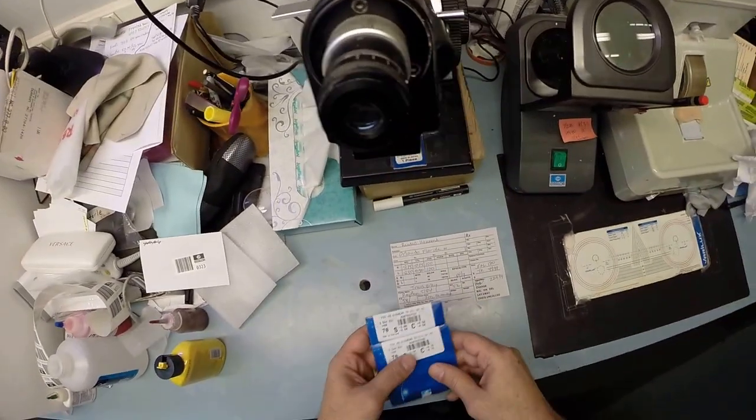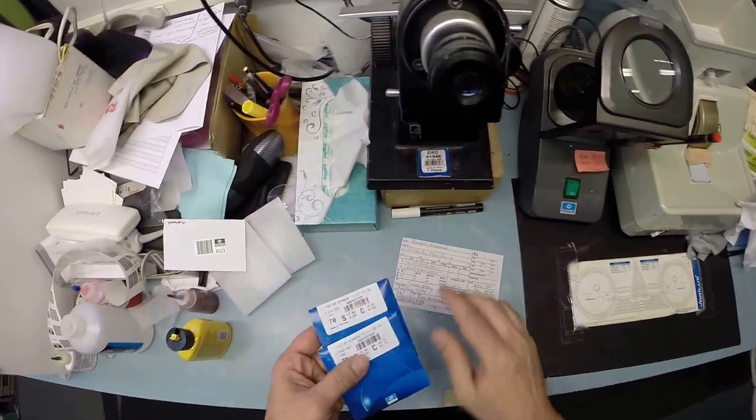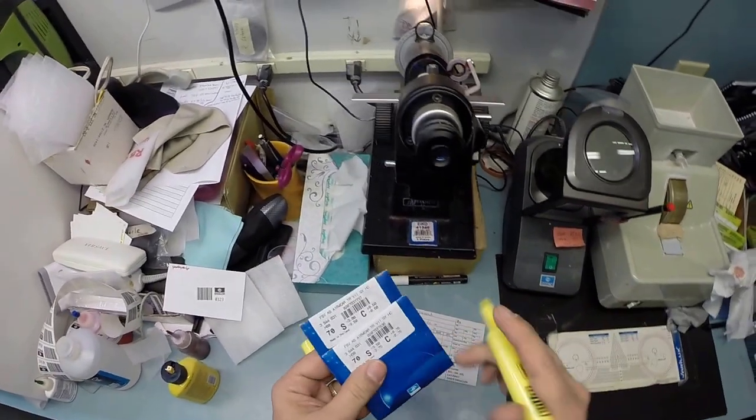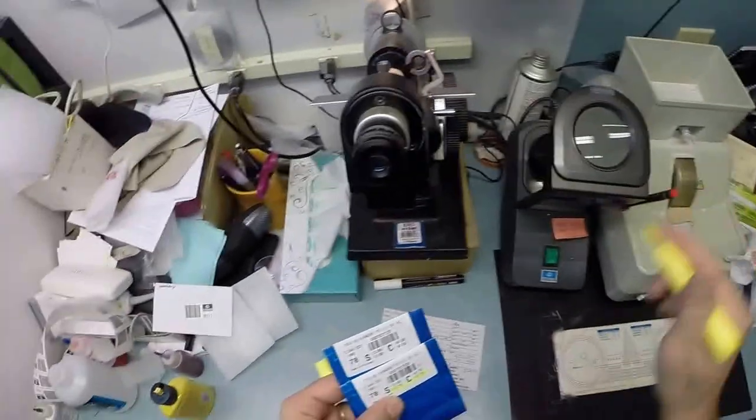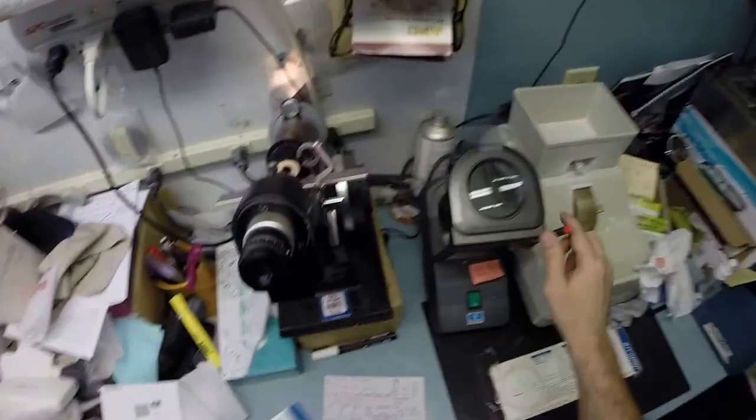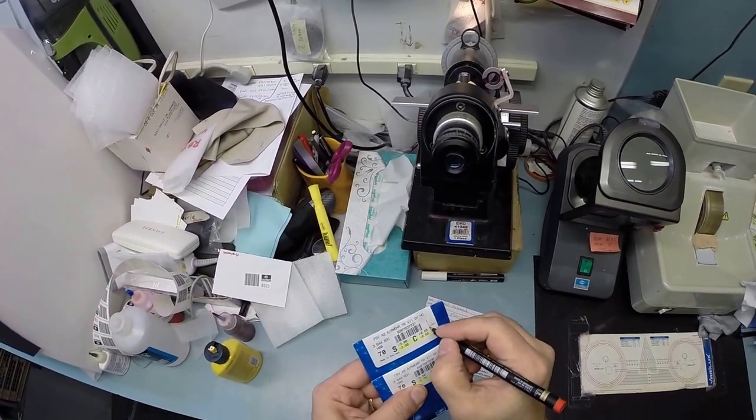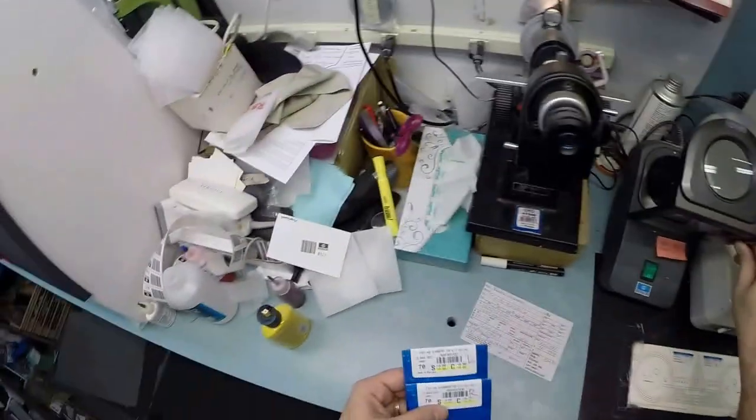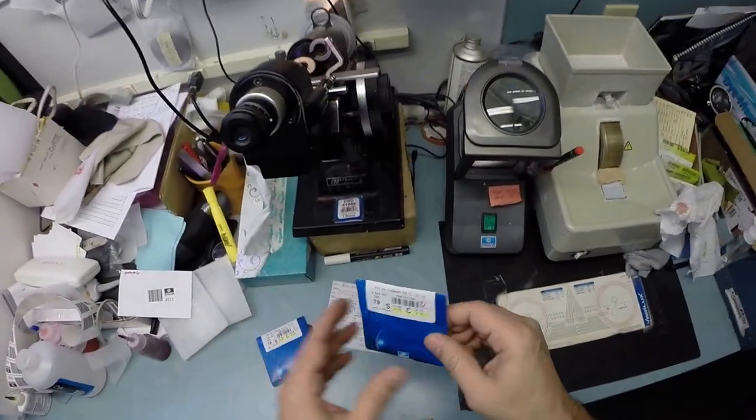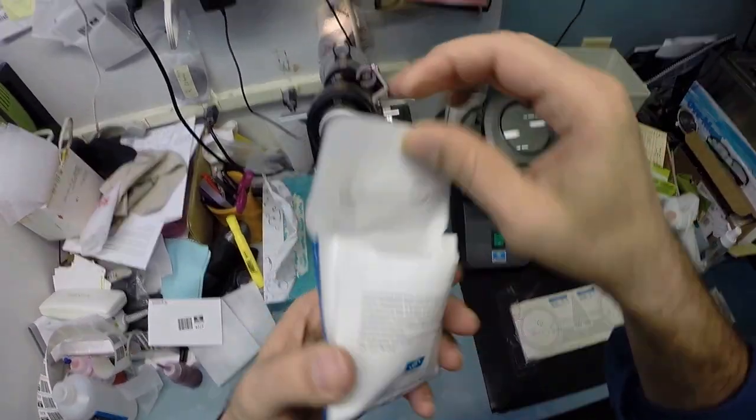Your right eye reads minus 2.75 minus 0.75 at 100. Let me highlight that for you: minus 2.75 minus 0.75. This is your right lens. And minus 2.50 minus 0.50 at 100 is your left. Let me mark this one left.